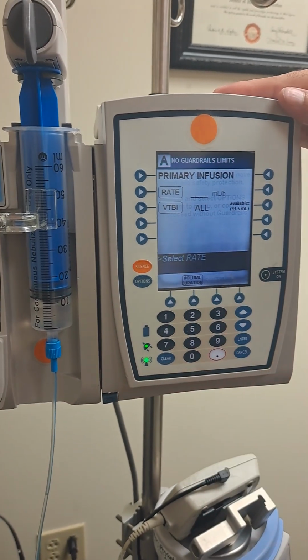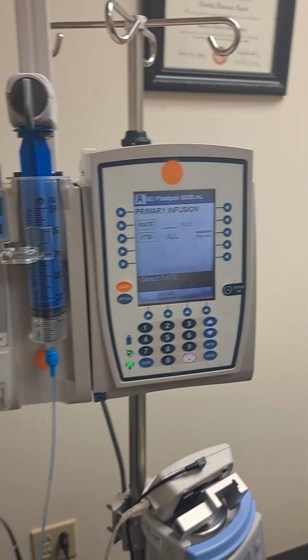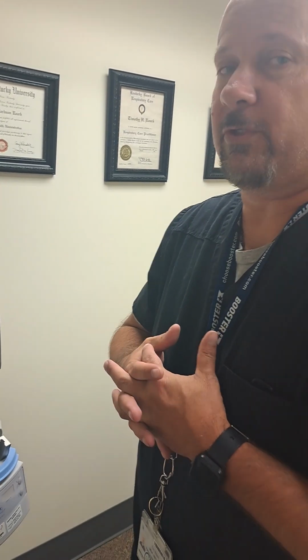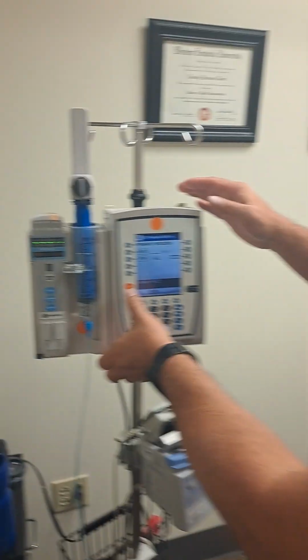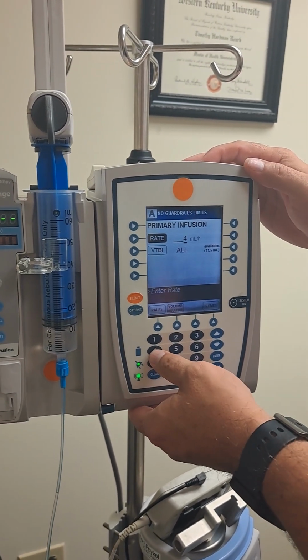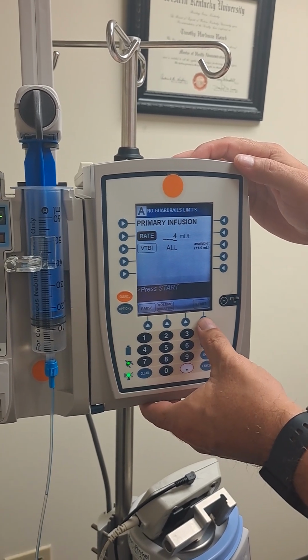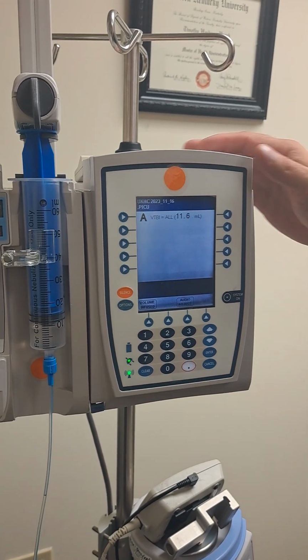Press confirm. Now we will choose the rate. Since we're using continuous albuterol, generally we will use 20 milligrams an hour. So we set the infusion rate on that at 4 mLs. But feel free to refer to the table that's inside the slides that will be sent in your email. But generally we set it up on 4 mLs. So I'm going to select the arrow beside the rate. Press 4 for 4 mLs per hour. And then I'm ready to start. So I'm going to hit start, and it has started.